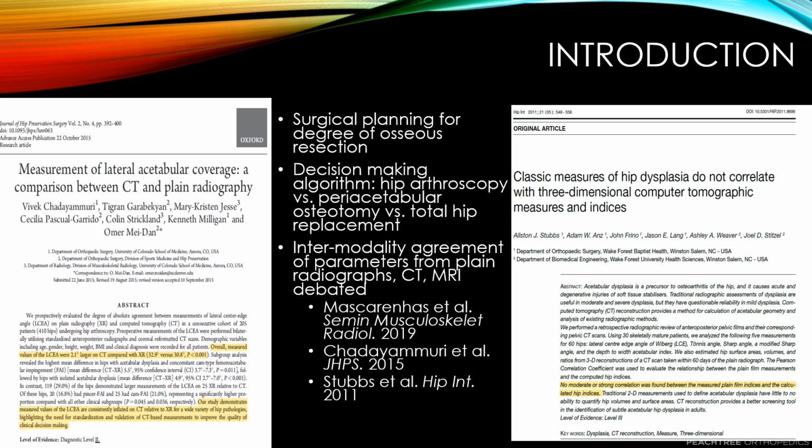Significant discrepancies in intermodality agreement between angles obtained from plain radiographs and from CT have been identified. A multimodal approach can be considered that incorporates multiple imaging strategies. In those patients who subsequently undergo surgical treatment, intraoperative assessment is also recommended.